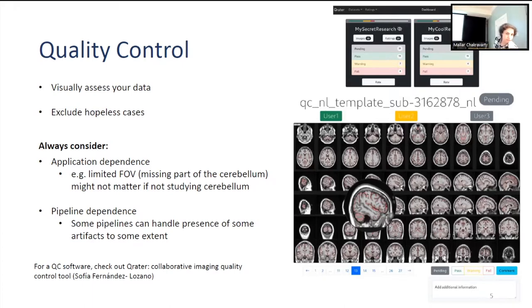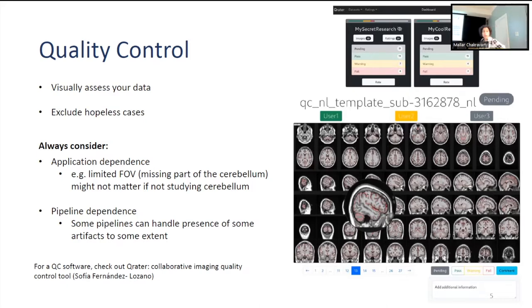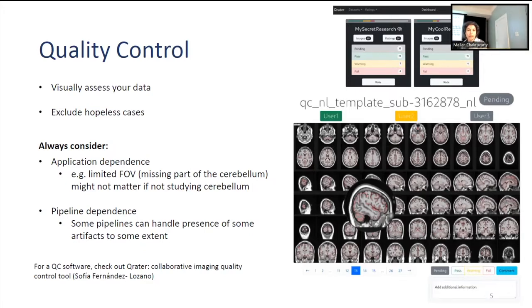This is a QC software that Sophia from Louie Collins' lab has developed. What I like about it is that you generate your own type of QC images, allowing different users to QC the data, label it, and use whatever type of QC images they like. Basically you need a software to QC and you need to look at your data to make sure the quality is good.